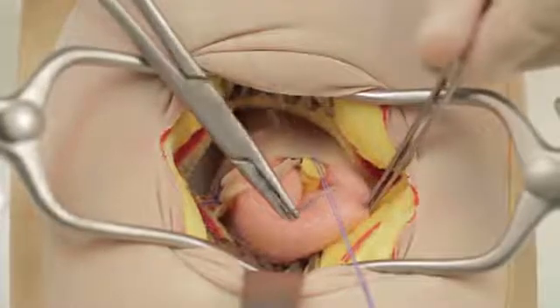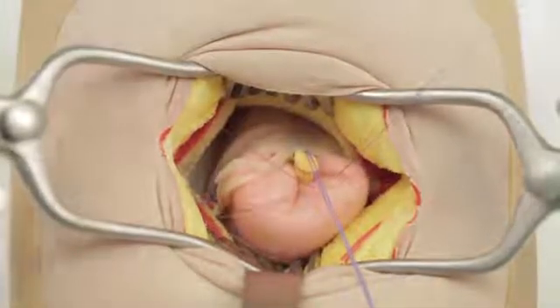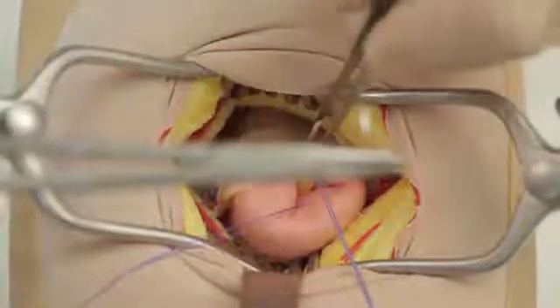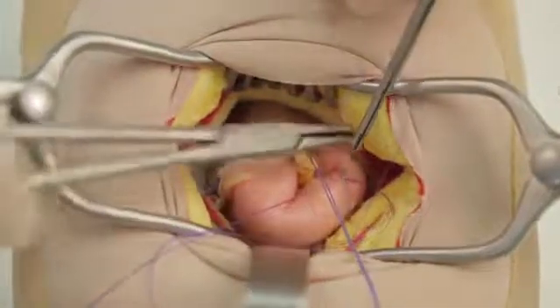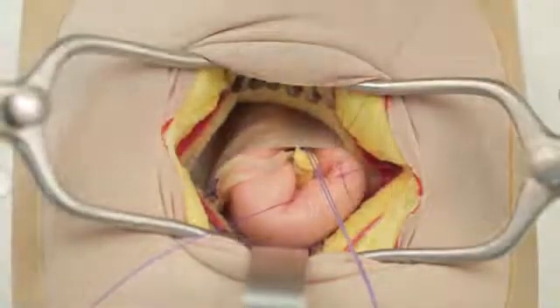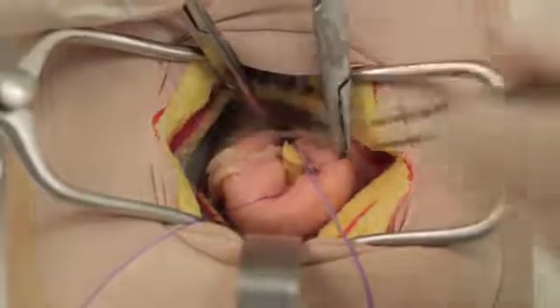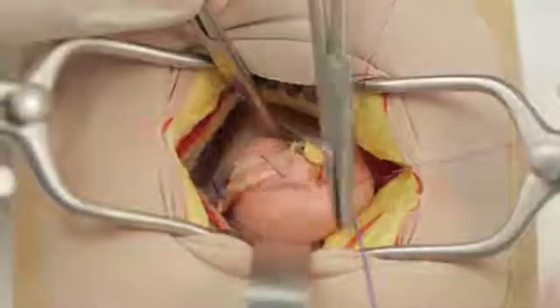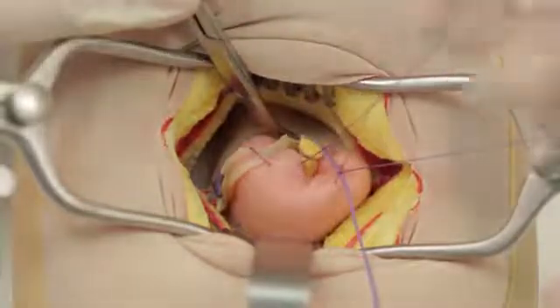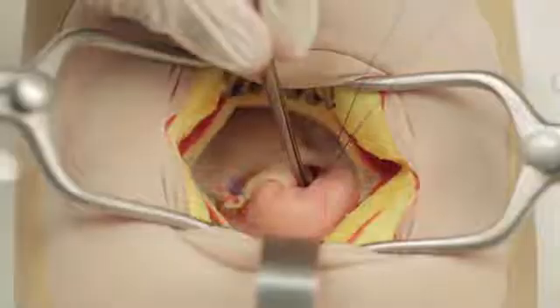Insert a seromuscular purse string suture of 2-O PDS or similar material on a round-bodied needle encircling the appendix base. Ask your assistant to push the appendix base using non-toothed forceps whilst you tighten the purse string to bury the stump.